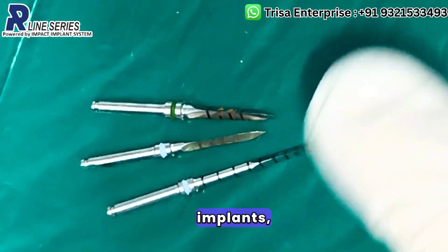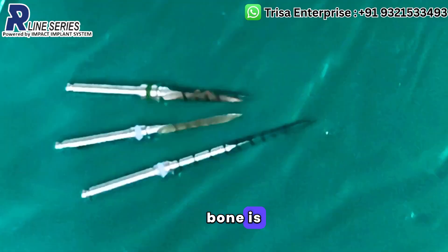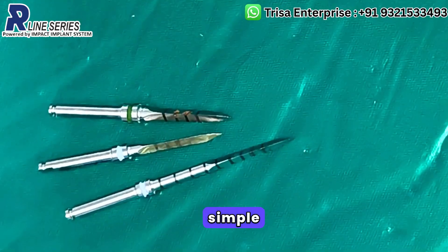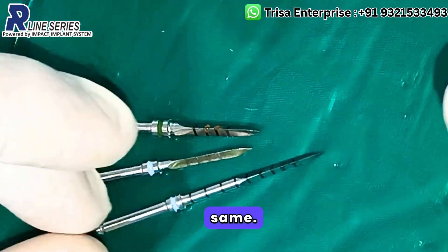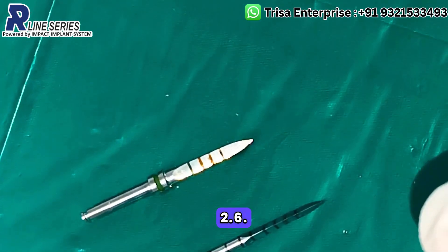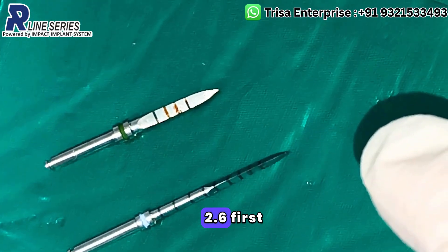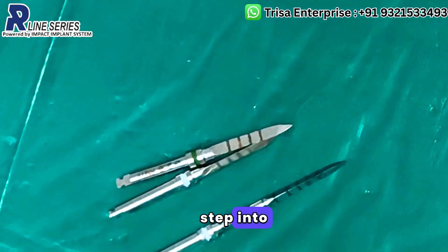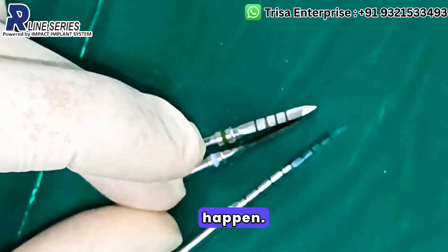If you are placing compressive KOS implants in the maxilla, the diameter of choice in the anterior maxilla, which is dense bone, is 3.7mm. The diameter of choice in the posterior maxilla, which is soft bone, is 4.1mm. Simple rule — length is predetermined. The drilling protocol remains the same: first drill and second drill, 1.8mm and 2.6mm. If you want to be more meticulous, you can add one drill in between. Now coming to the mandible.